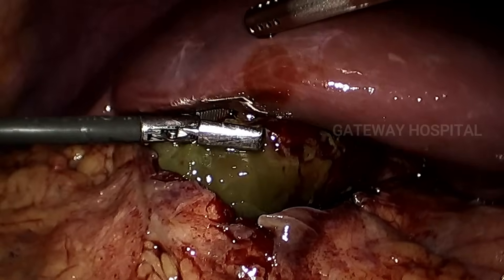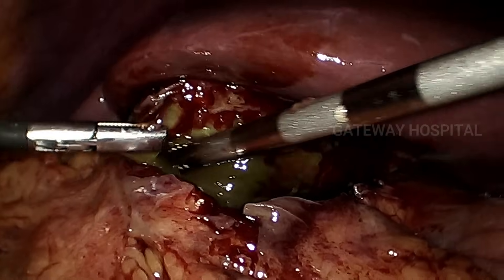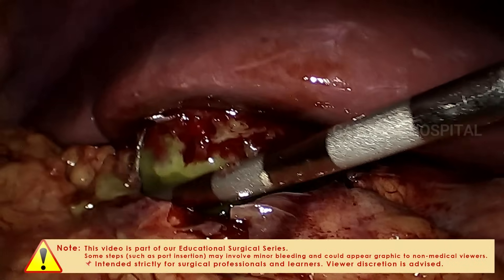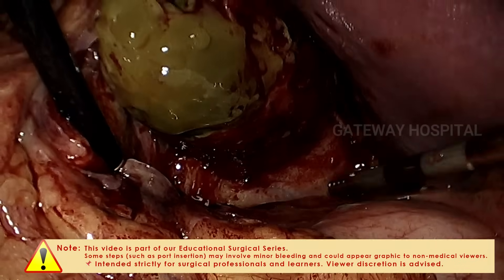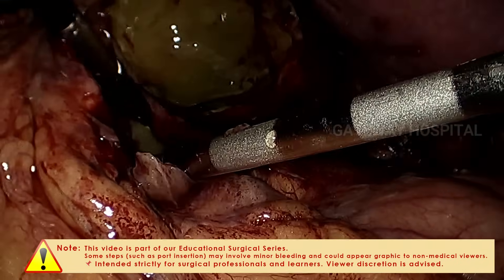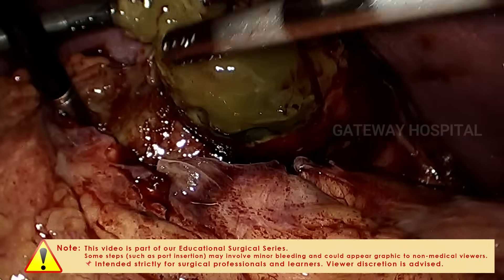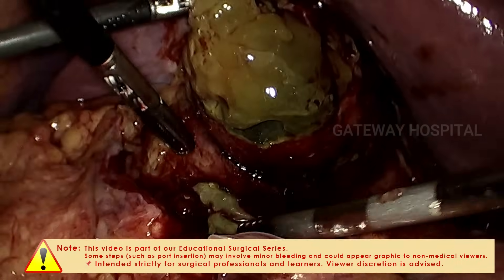Now we can see there is gangrene at the fundus of the gallbladder. The gallbladder is carefully separated from the surrounding adjacent structures by using a suction cannula. In open surgery we do finger dissection in difficult situations — similarly, the suction cannula can be used to dissect the tissues away from the gallbladder.